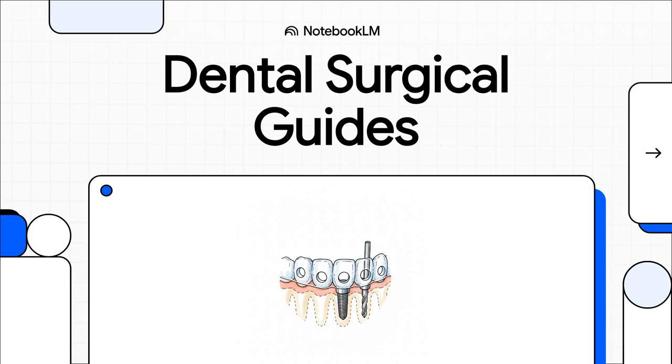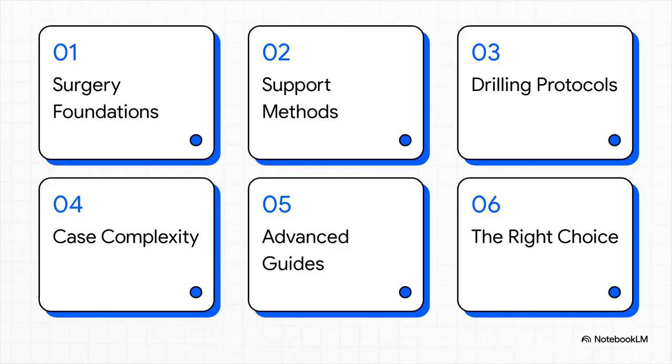We're going to demystify this complex taxonomy of surgical guides and turn it into a clinical framework you can actually use right away. We're moving past the old guesswork of freehand placement to see exactly how specific anatomical situations demand very specific guided solutions. Okay, let's dive into this and look at our roadmap.